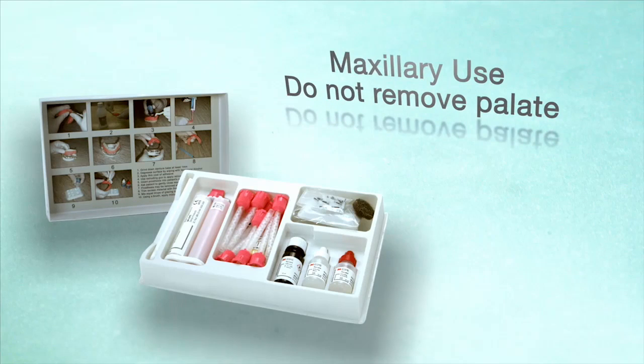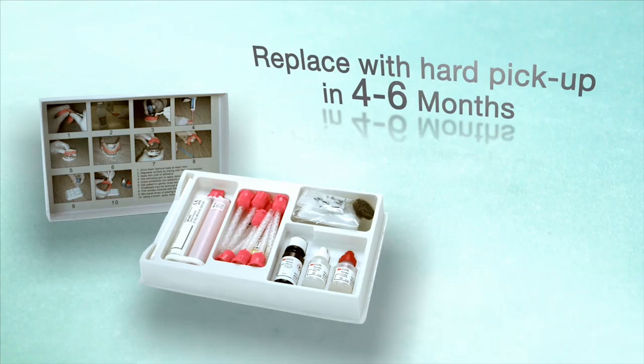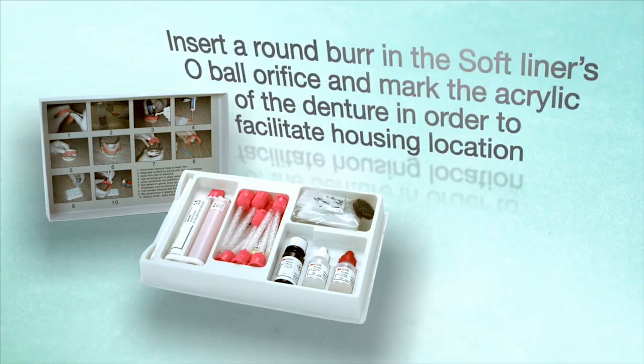For maxillary use, do not remove the palate during this stage. Instruct the patient to keep the denture in place for the first 48 hours after placement to prevent tissue overgrowth. After four to six months, the soft liner can be replaced with a hard pickup of the MDI metal housings to increase the level of retention. You can insert a round burr in the soft liner's O-ball orifice and mark the acrylic of the denture to facilitate housing location.